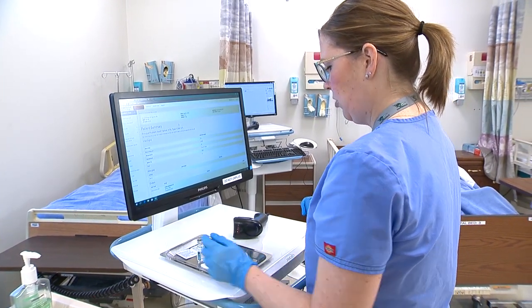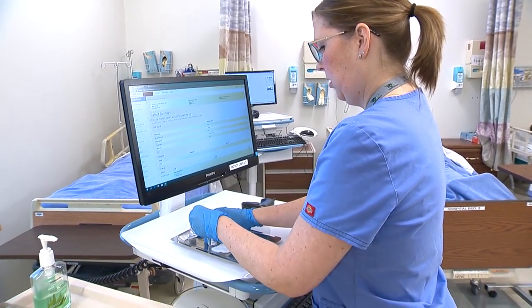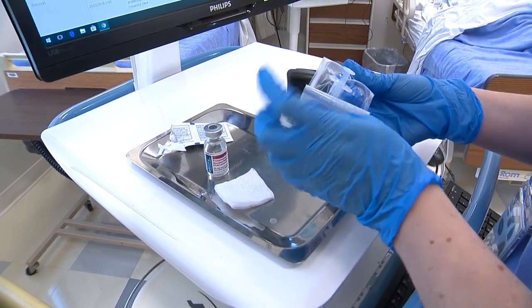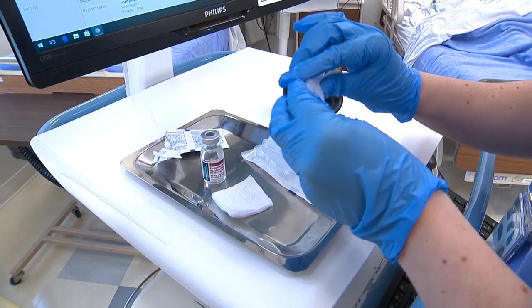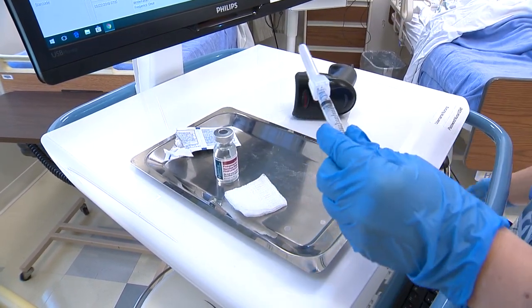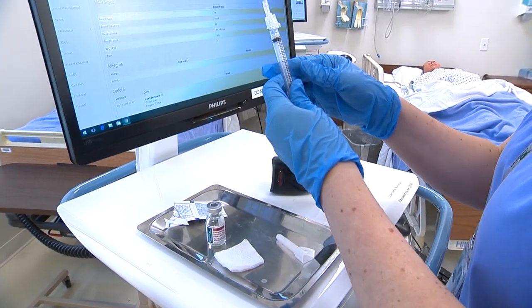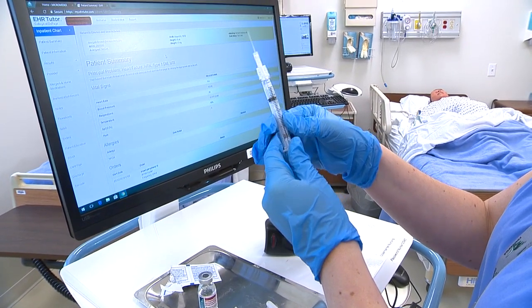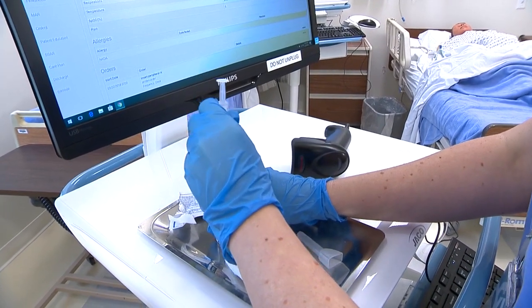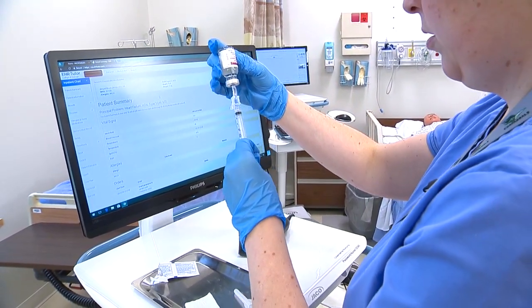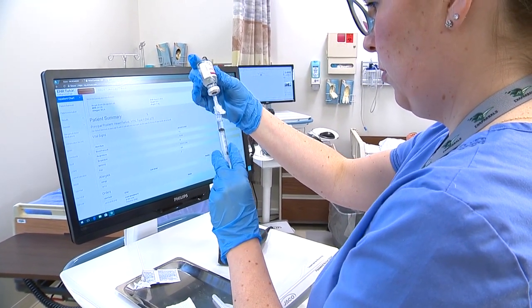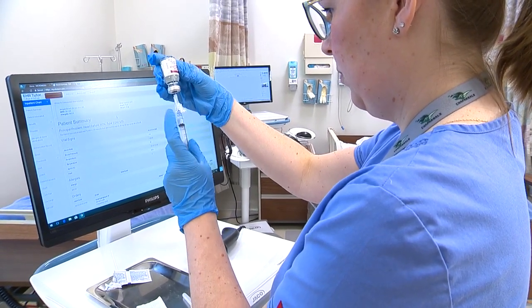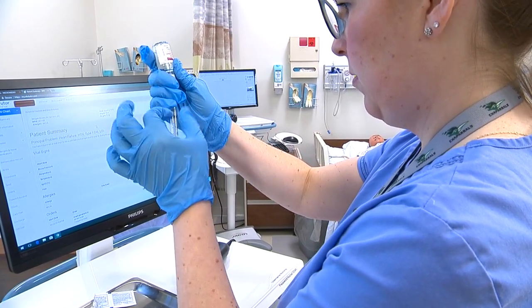Now I'm going to prepare my medication. I'll scrub the top of the vial with alcohol, take my needle and assemble it. I'm going to draw up air — the same amount I'm to administer, a little over. Since I'm giving 0.5 mL, I'll draw up just past 0.5, inject the air into the vial, then draw up 0.5 mL or a little more to ensure no bubbles. There are a few bubbles, so I'm going to get that air out.